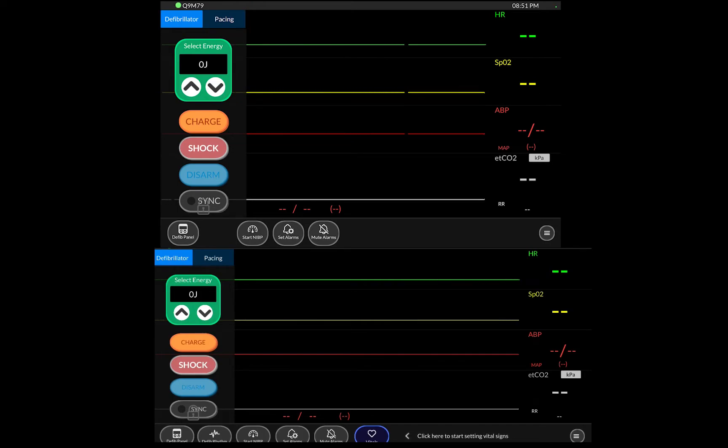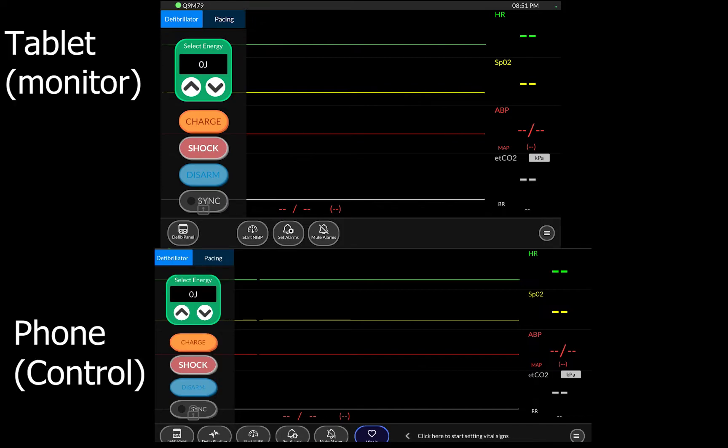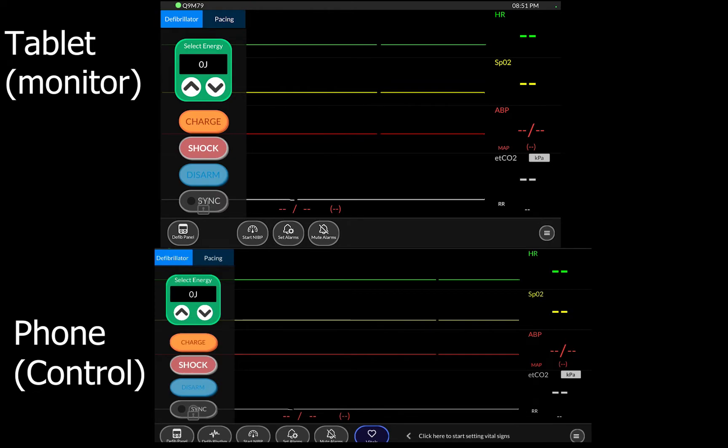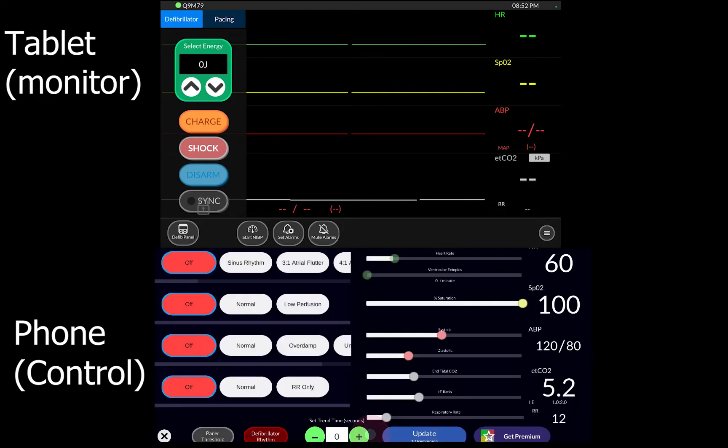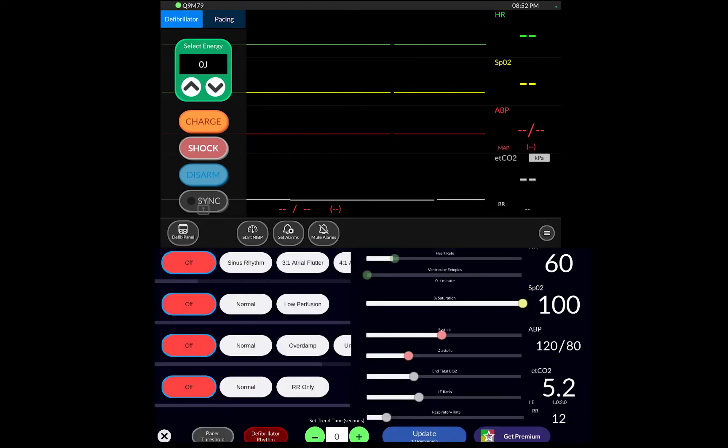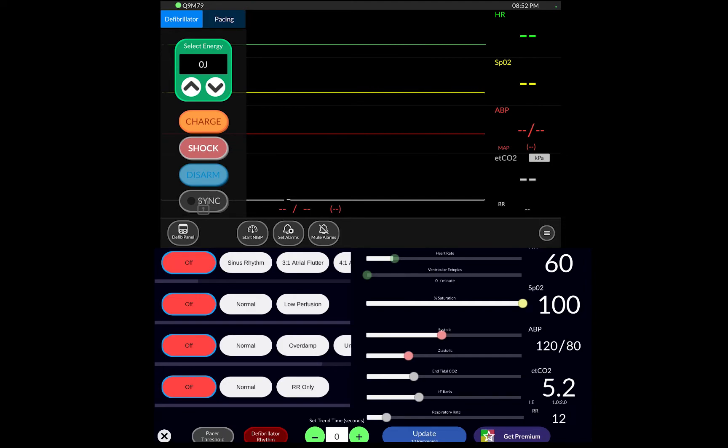What's important to understand is that the phone, the thing that controls the monitor, is the main one that you started the simulator with. On this one the thing that's different here is at the bottom in the middle you can see it says vitals. If I click vitals it then gives me this whole panel in which I can then control the rhythm and the saturation and the BP and the ETCO2 and all these sorts of things.